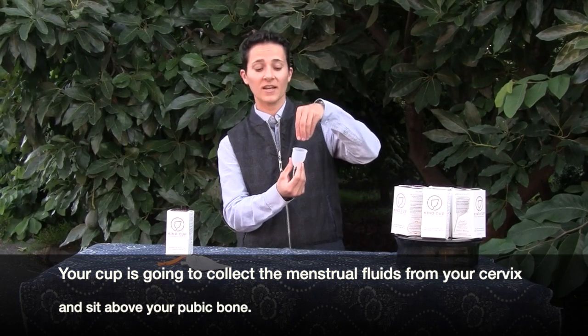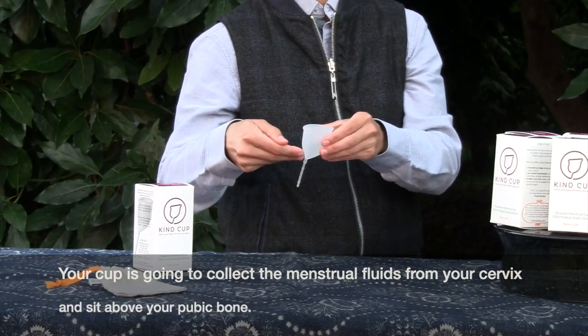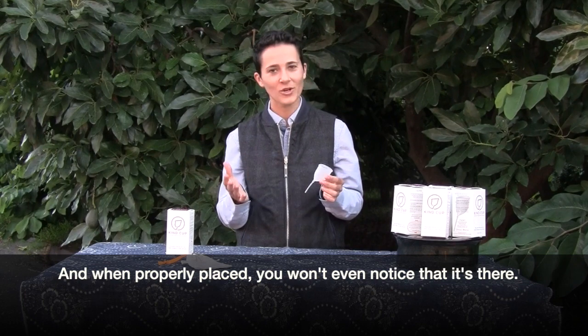Your cup is going to collect the menstrual fluids from your cervix and sit above your pubic bone. And when properly placed, you won't even notice that it's there.